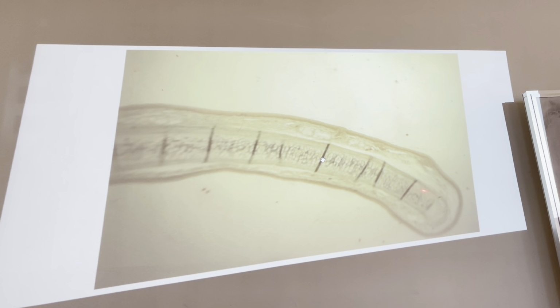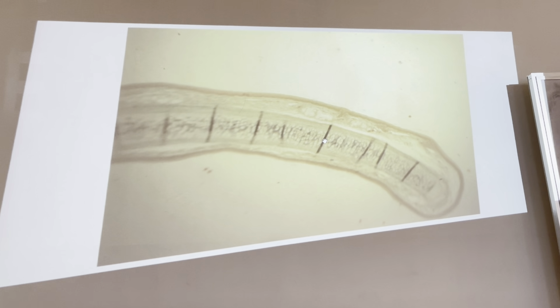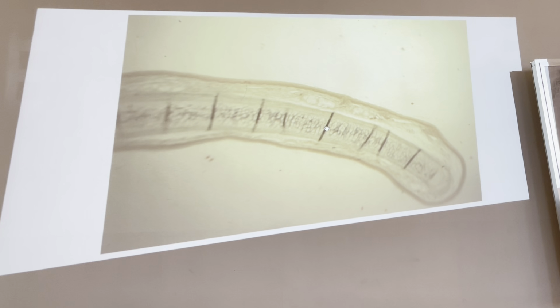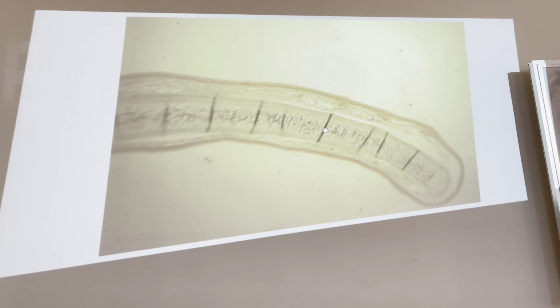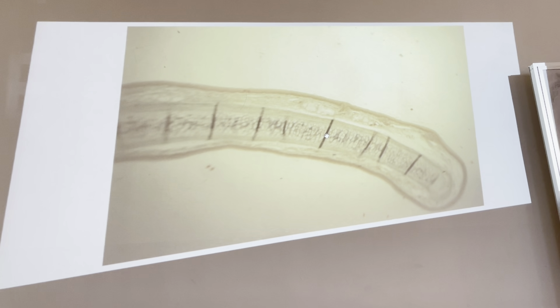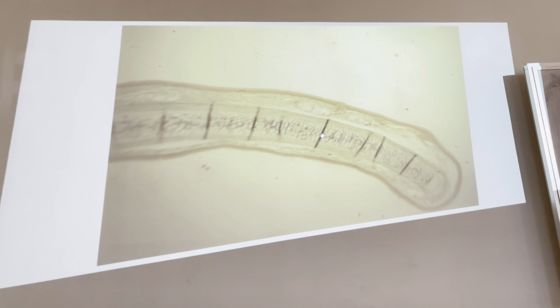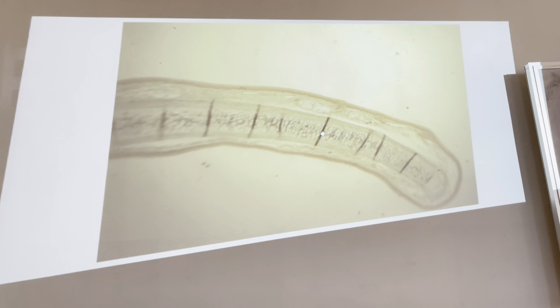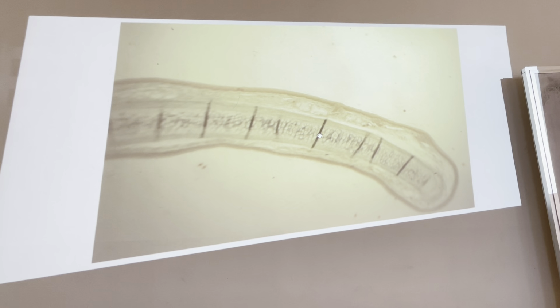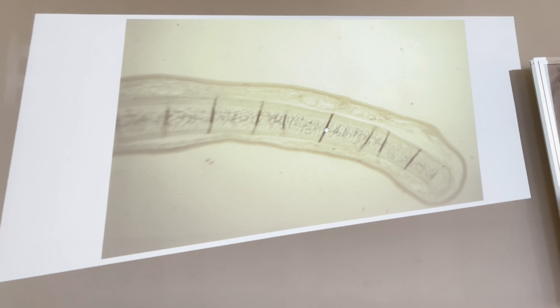So this is the epiglottis. At the upper surface of the larynx, we have the epiglottis. The epiglottis is completely a cartilaginous structure, which is elastic because it consists of a huge amount of elastic fibers. It has two surfaces, either the lingual surface or the laryngeal surface. When we say laryngeal, it faces toward the larynx. Otherwise, the lingual surface faces the oral cavity.